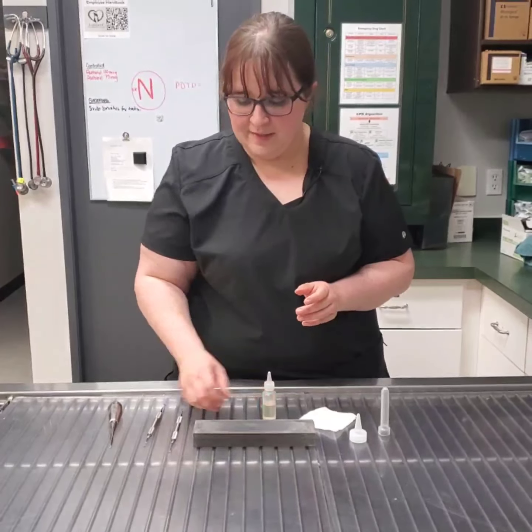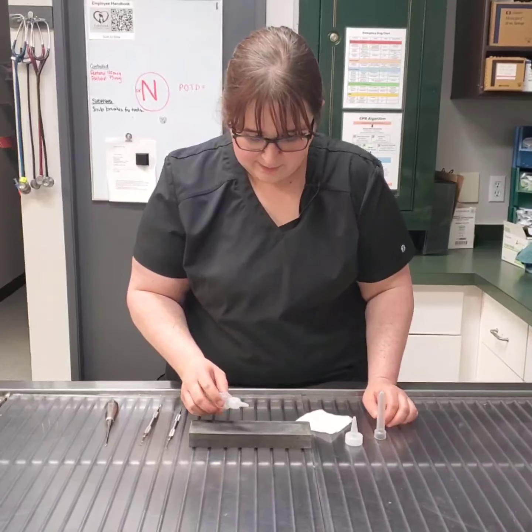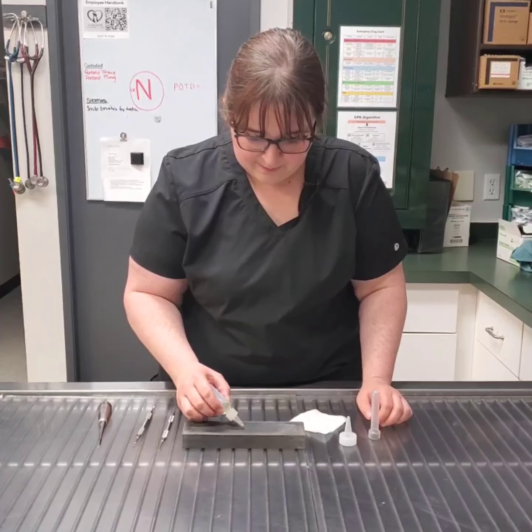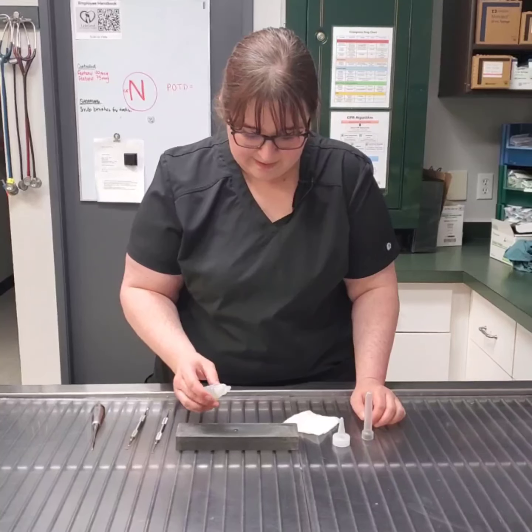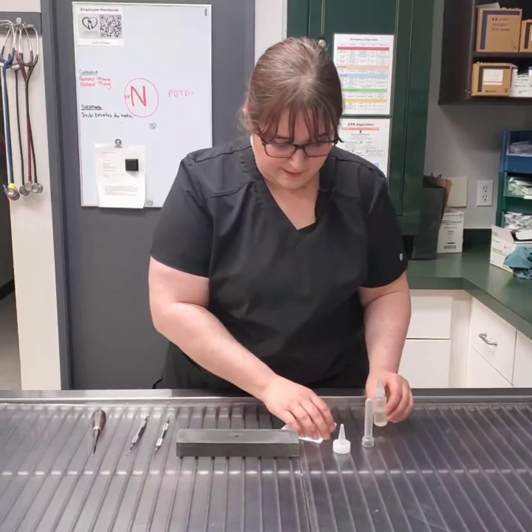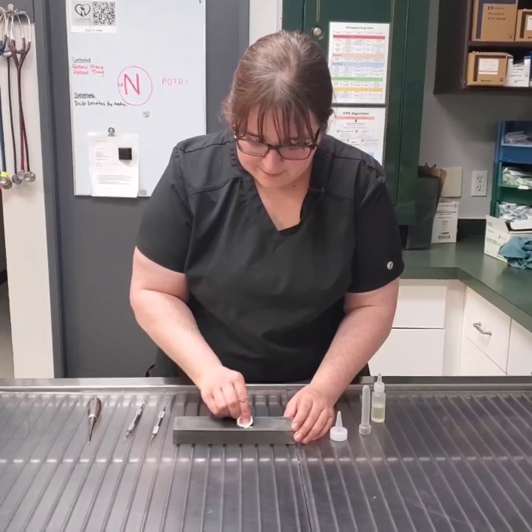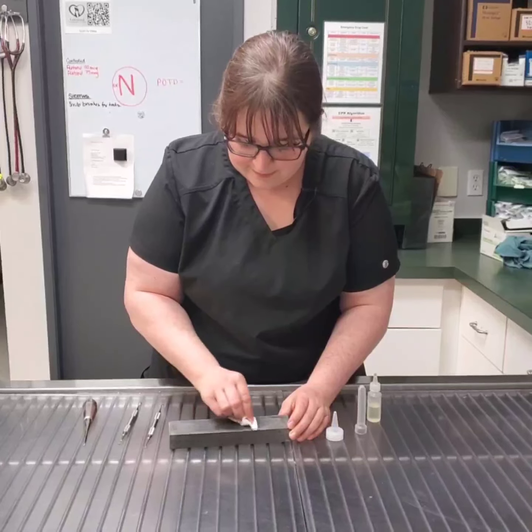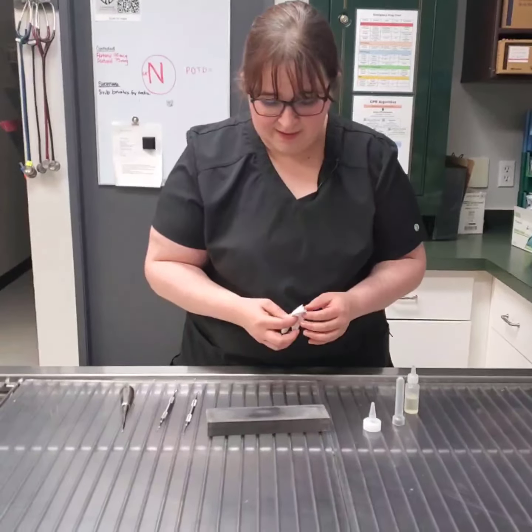So to start off with, I'm going to be sharpening the scaler, and I'm going to put one or two drops of the oil onto the sharpening stone, and I'm just going to take the piece of gauze and I'm going to spread it out so that our oil is more dispersed, so that it's not all in one place.